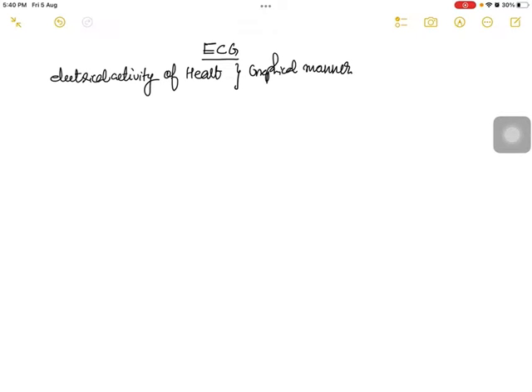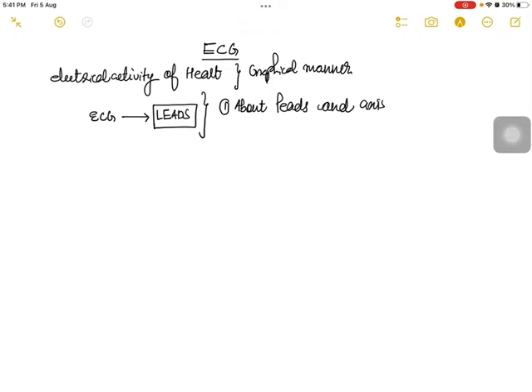So that's it. Now, whenever you hear about ECG, there is a word that always comes to your mind, that is leads. This word will come to your mind every time you hear ECG. When you deal with ECG, you have to know something basic about leads. So what we'll be learning first is about leads, the axis. That's our first priority, especially this axis.